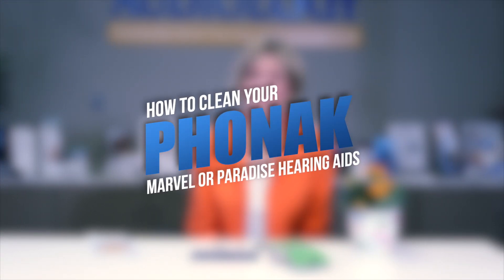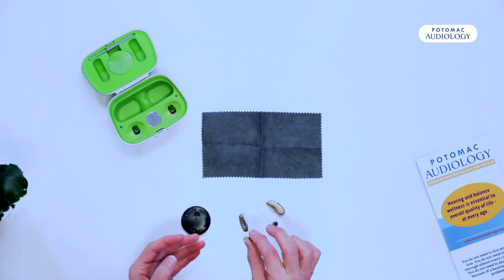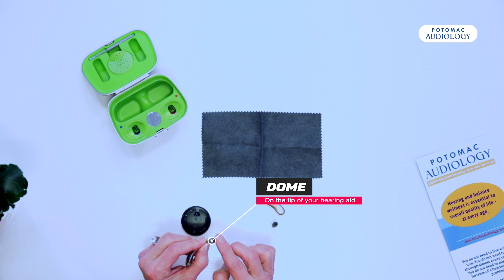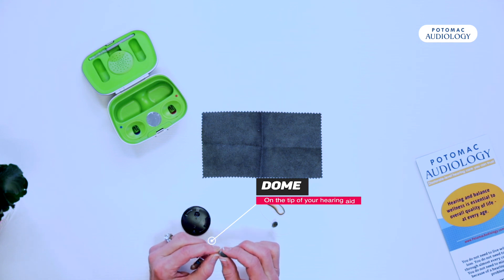Welcome to Potomac Audiology. I'm Dr. Gail Lynn and today I'm going to go over how to clean your Paradise or Marvel hearing aids from Phonak. Your hearing aids have a dome on the tip that goes in your ear, and that dome can get wax on it periodically. If wax gets on the dome, the hearing aid can either be weak or stop working altogether.